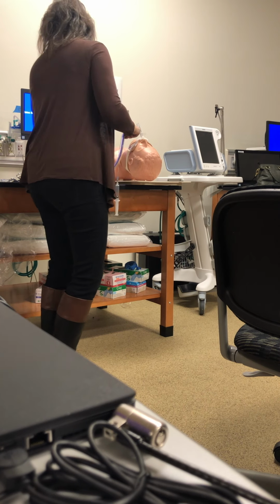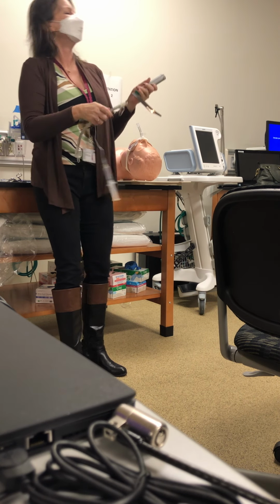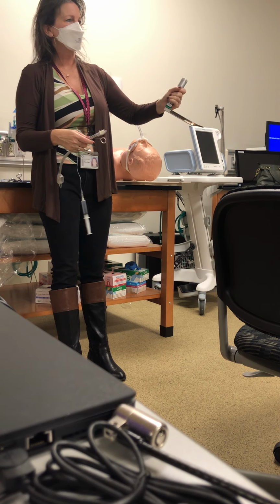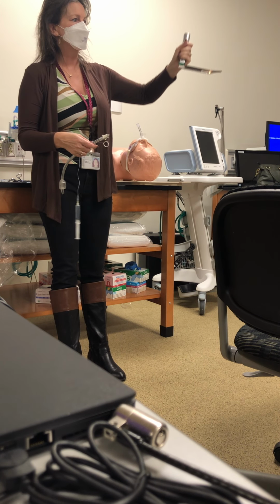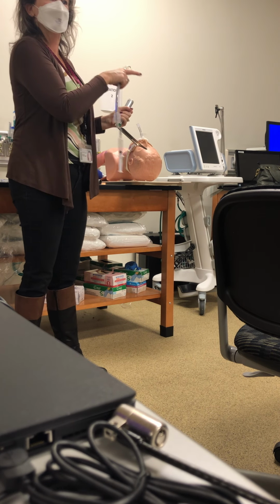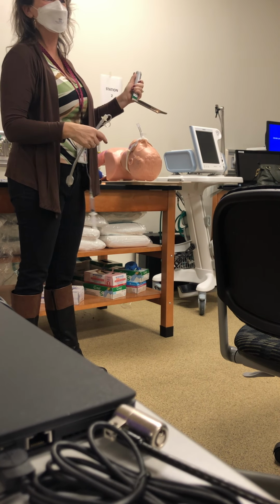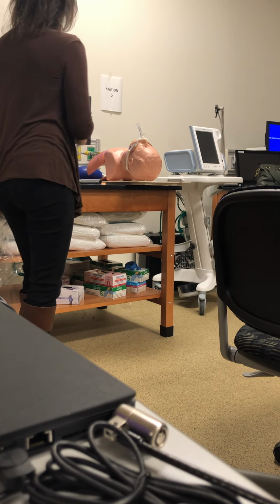The Miller is going to fit underneath the epiglottis, so it's going to lift it directly. Okay, so this one lifts it directly. All right, the Macintosh lifts it indirectly because it sits in the vallecula, lifting the epiglottis indirectly. This one lifts the epiglottis directly.